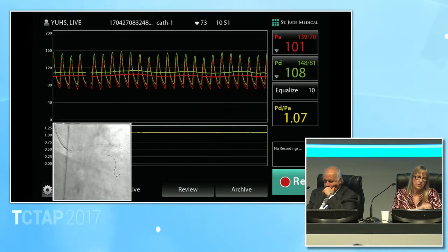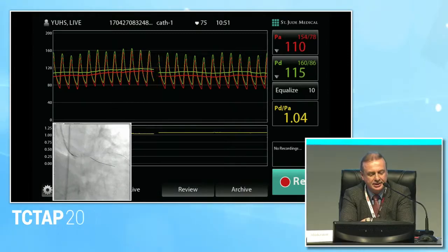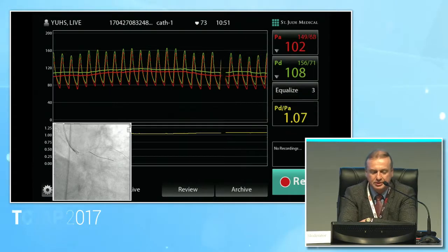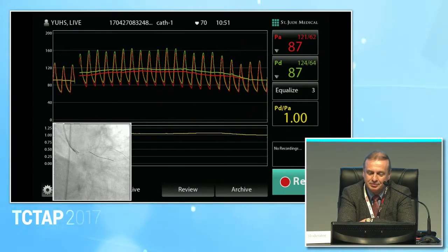There was a very good comment, I guess, from Julia. Of course it's not always very easy if you have some tortuous arteries and quite complex PCI to measure the FFR, and then maybe it's even sometimes a bit harmful.